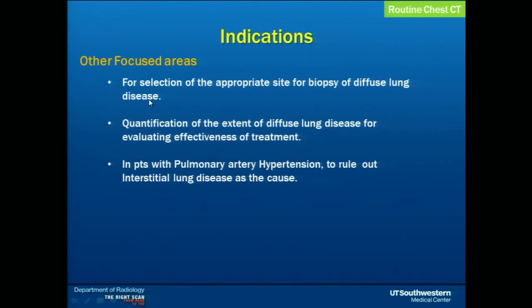Additional indications also include to select the appropriate site for biopsy of diffuse lung diseases, to quantify the extent of diffuse lung diseases and evaluate effectiveness of treatment, and in patients with pulmonary artery hypertension to rule out interstitial lung disease as a cause.